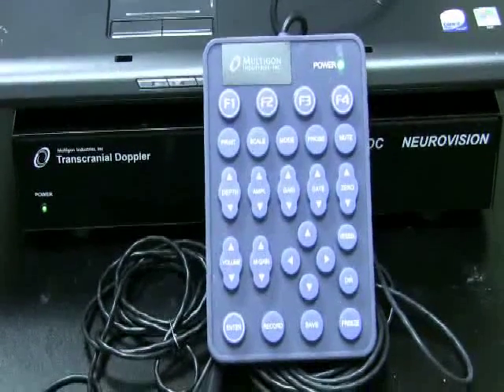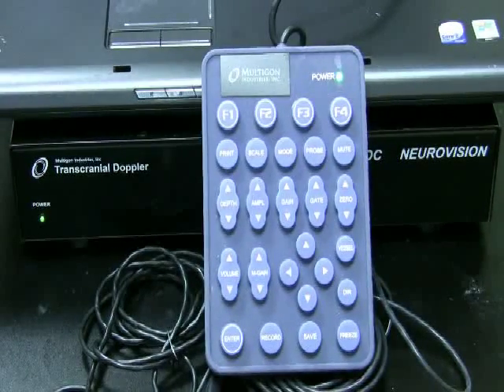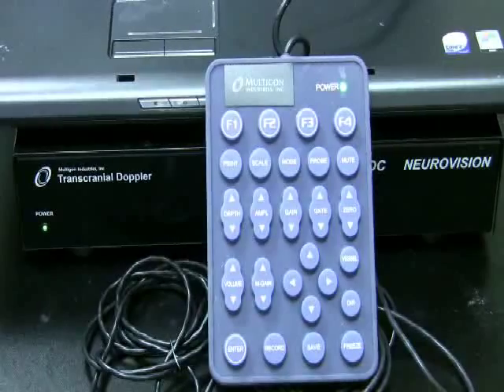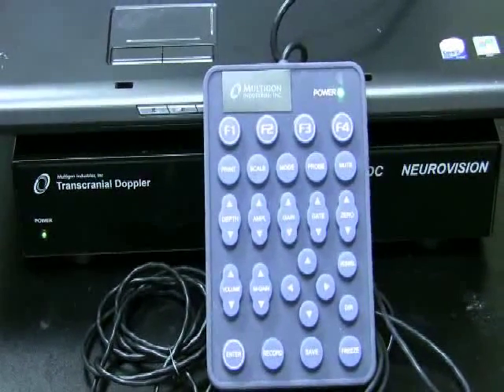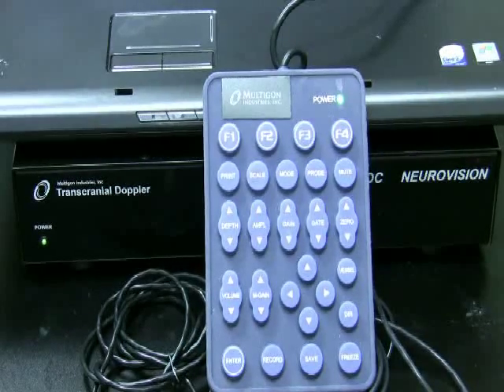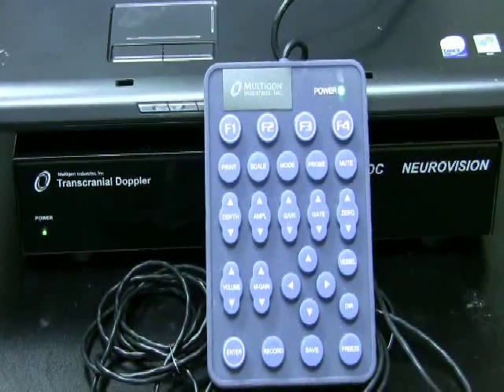In recent years, we have upgraded the trackball to a keypad. The keypad can do all the functions from the keypad remotely. Scale, zero line or baseline on the previous models. Scale would be range. You can increase the depth, amplitude, gain, gate, volume. You can save, you can record, you can select the vessel, all from the keypad.